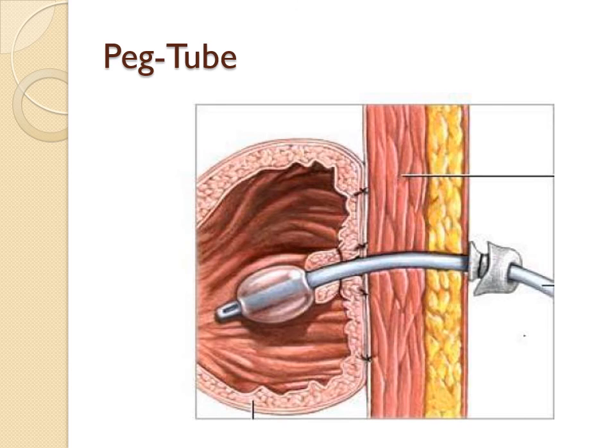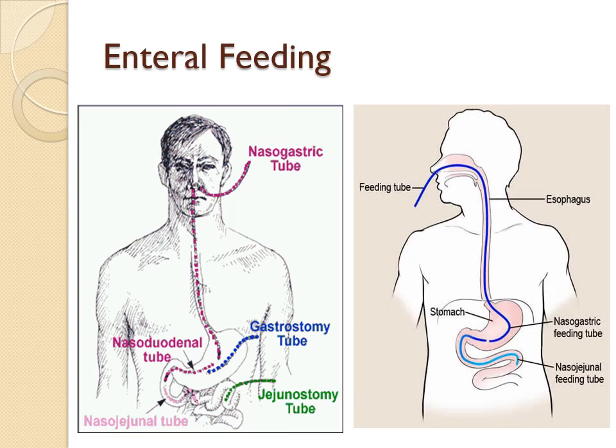The important thing that you must always remember when the patient has a PEG tube is, whatever reason the tube is in, it is dedicated to the fact that something above that cardiac valve, that sphincter at the top of the stomach, going to the esophagus, is no longer working correctly, so that this patient is at high risk for aspiration. Therefore, never, ever, ever should this patient be placed in a flat position.